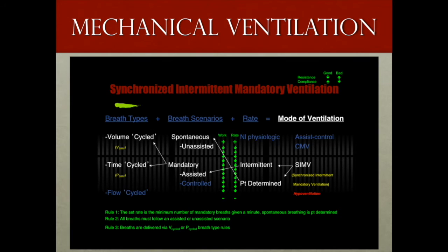The next mode of ventilation that we'll talk about will be synchronized intermittent mandatory ventilation.